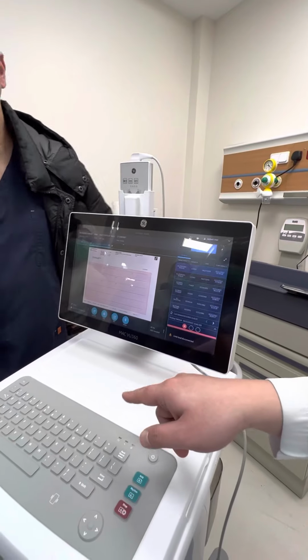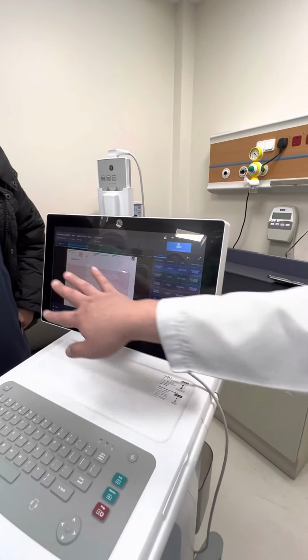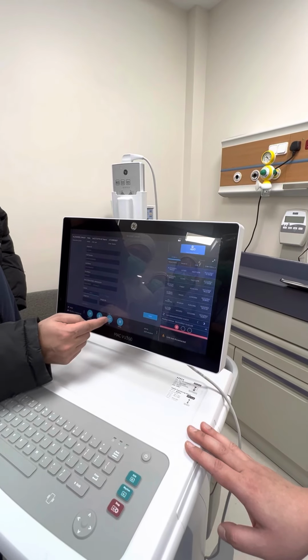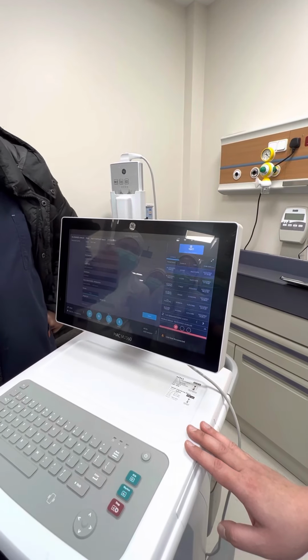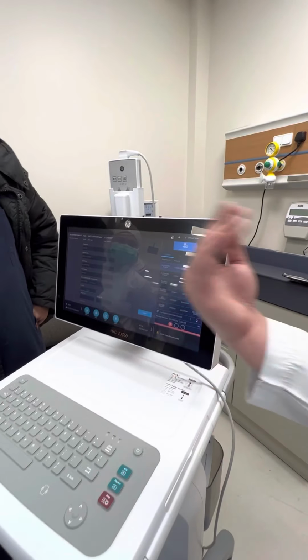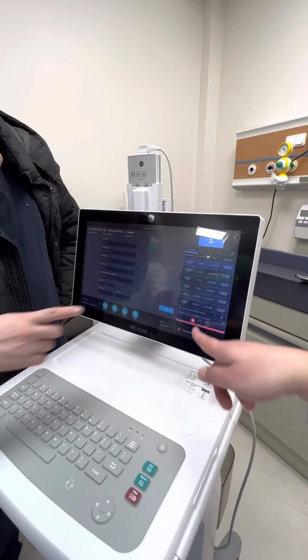So how can we remove the attachment? You cannot remove the attachment. Even if you want to, you cannot edit and delete, because we attached it from the list, so it brought all the patient demographics with that order. So there is no way to remove it if, by mistake, for example, you attach the wrong ECG to this patient.